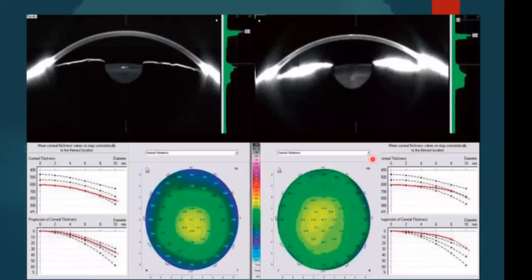Now, an interesting thing that I want to tell you is this case. I don't know if you all can see the pachymetry. The pachymetry is actually 600 plus. And this corneal curve, we've always seen either normal curves which are parallel to these 2 lines, or curves that dip more, so they're more angulated. But what about curves that are flattened like this? What do you think they represent?